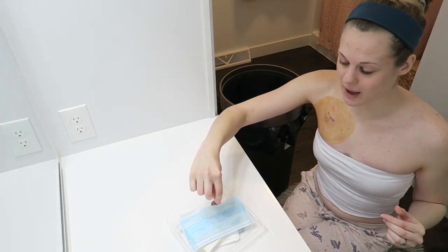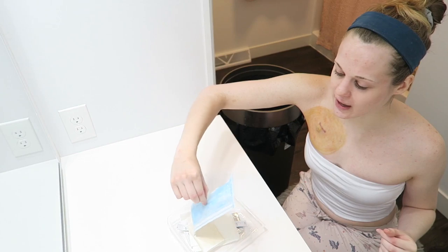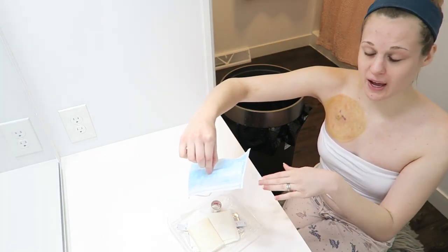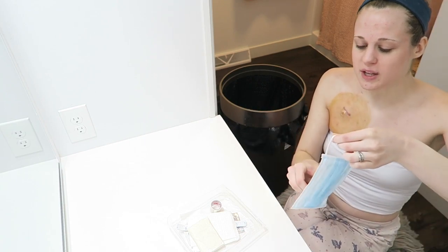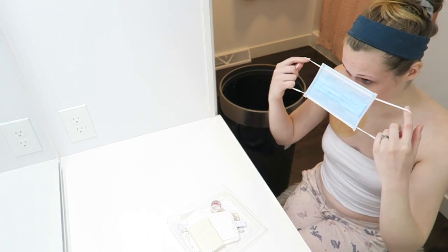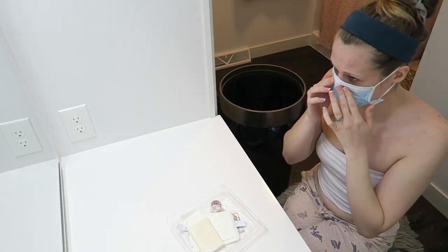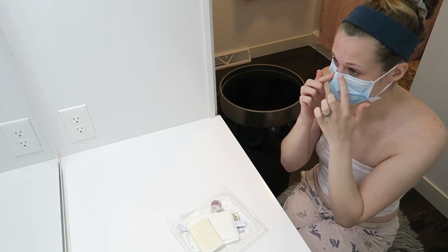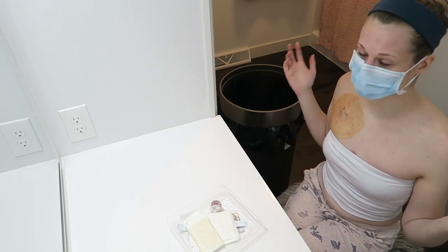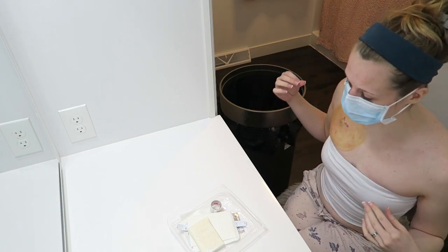I'm going to pinch the mask. And the mask technically isn't sterile. It's sterile in the package, but once you take it out, it's not necessarily sterile because it is going on your face and your face is not sterile. With the mask, you pull it down and then you pinch it by your nose to make sure that it is on securely, just like that. And you will be wearing the mask the entire time you are accessing.